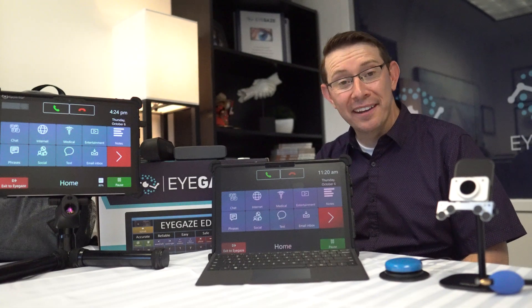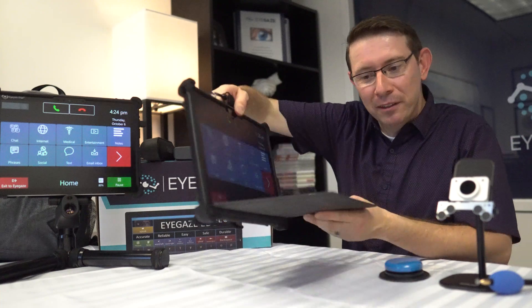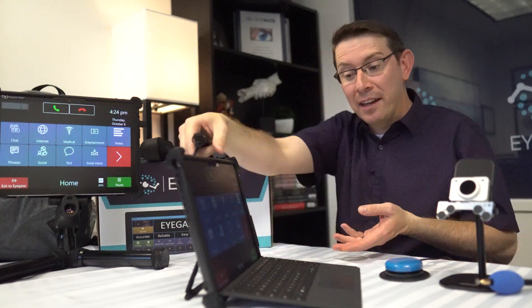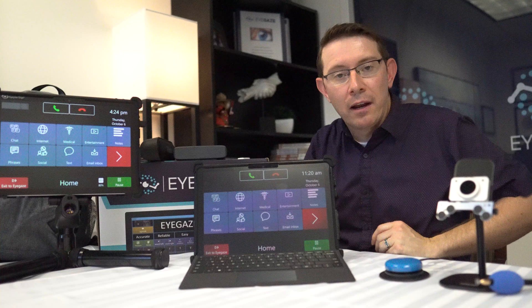We're excited to show you the new iGaze Edge product lineup. Here we have the iGaze Edge tablet in its new protective case. On the back you'll see it has a kickstand on the top, a nice carrying handle, and it comes with this detachable keyboard and mouse trackpad.